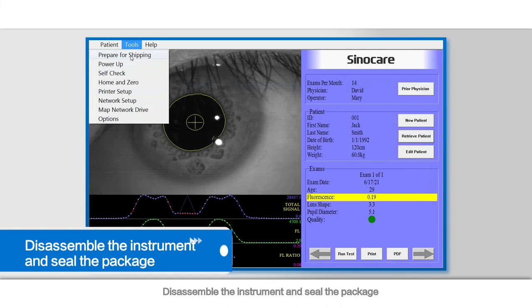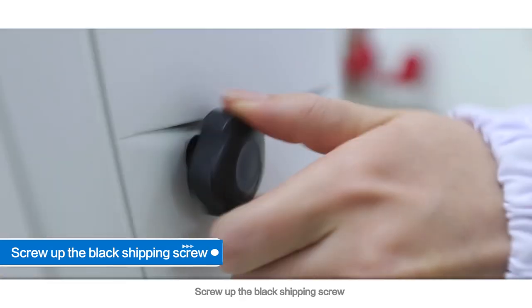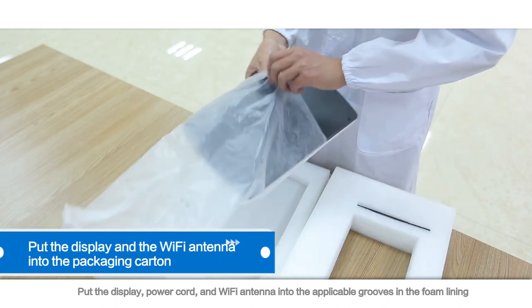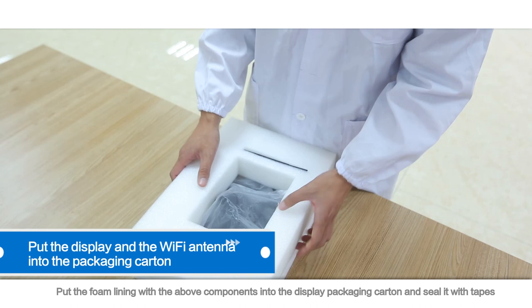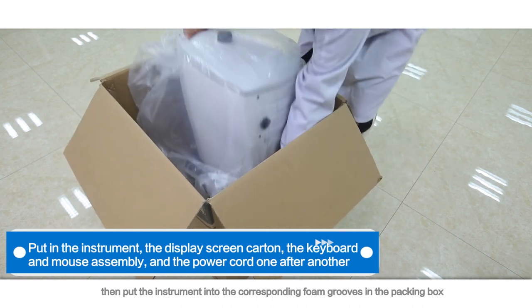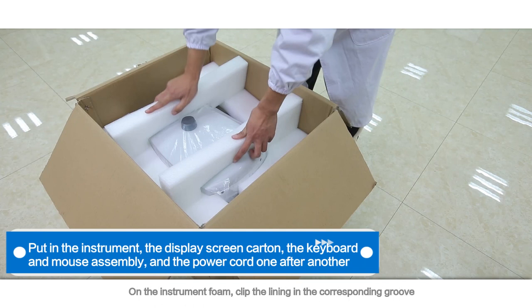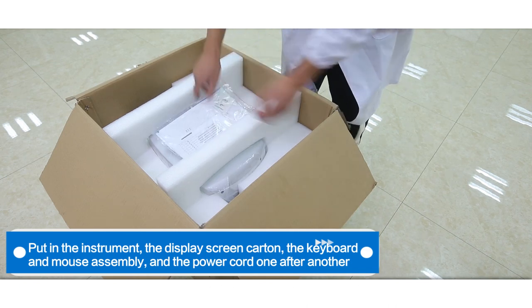Disassemble the instrument and seal the package. Shut down the instrument and set the transportation mode as done in the shutdown operation before transportation. Screw up the black shipping screw. Rotate to remove the touch display screen and its data wire and the Wi-Fi antenna. Put the display, power cord, and Wi-Fi antenna into the applicable grooves in the foam lining, then put the foam lining with the above components into the display packaging carton and seal it with tape. Open the instrument package and put the lower foam lining at the bottom, then put the instrument into the corresponding foam grooves in the packing box. Place the display carton and the keyboard and mouse assembly at the left side of the instrument and fill the gap with the isolating foam. Clip the lining in the corresponding groove on the instrument foam and reconfirm that all items have been packed in the carton. Seal the package with tape.